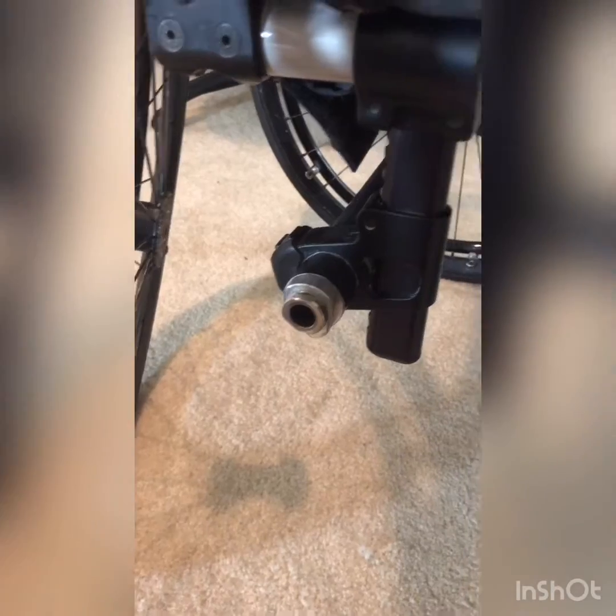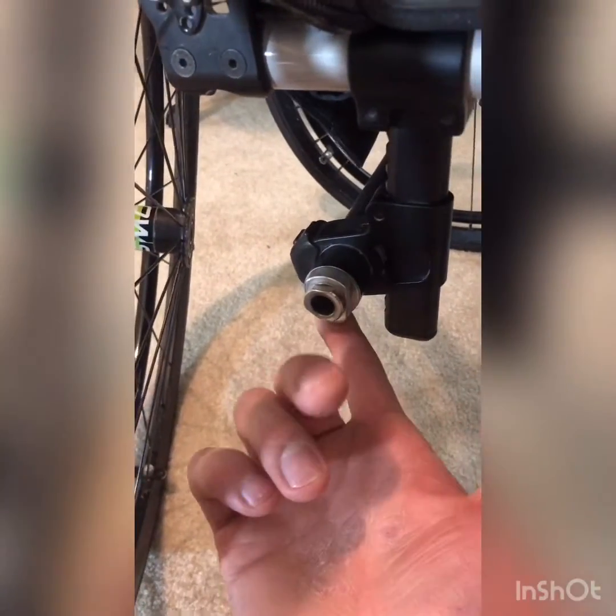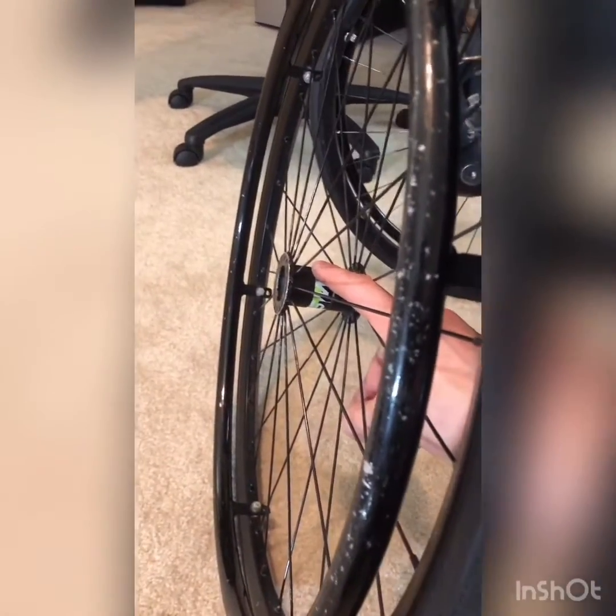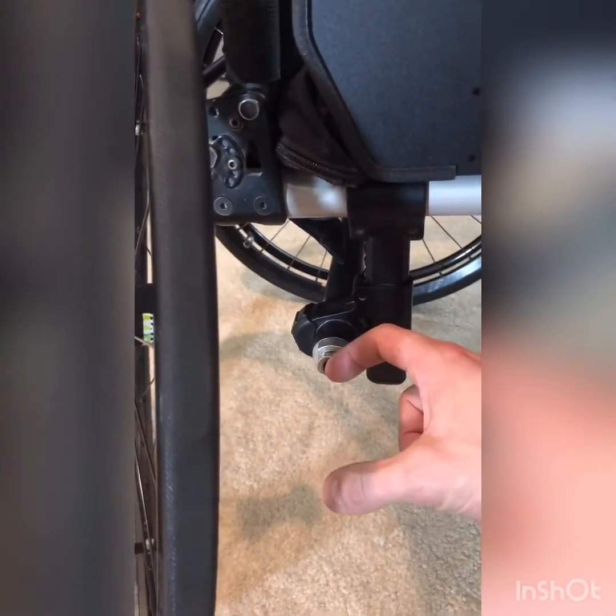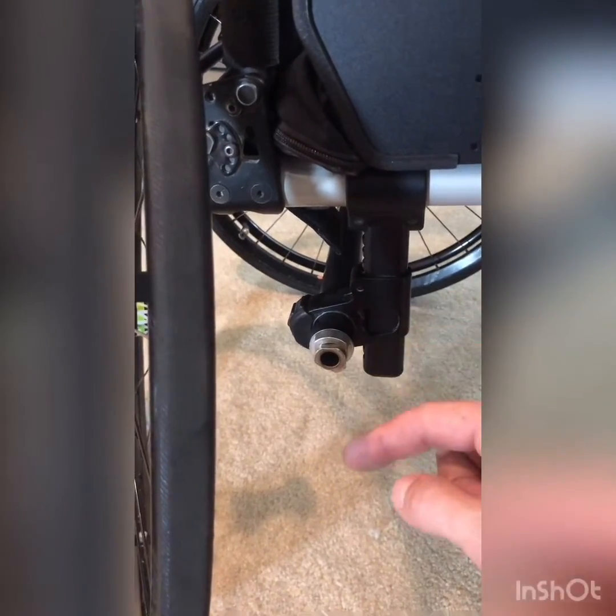So we have a four inch pin and a two inch hub, which means our axle sleeve is exactly two inches — because four inches minus two inches equals two inches. Now if you have a different size wheel and you're trying to determine what pin to buy, all you have to do is take that axle sleeve length of two inches and add it to the hub size of the new wheel. For example, if you're ordering a product with a two and a half inch hub, you'll need a four and a half inch axle pin, because two inches of axle sleeve plus two and a half inches of hub requires a four and a half inch pin.